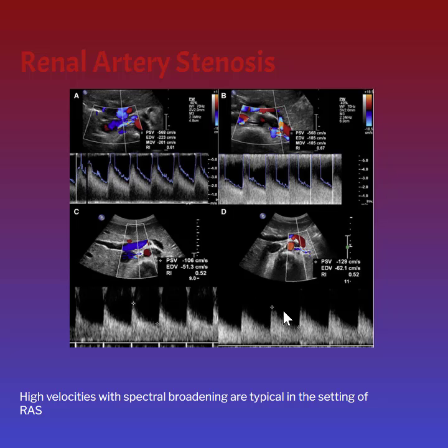And that is the end of our review of renal artery stenosis. You will study this more in depth in your vascular classes, and board questions will be more prevalent on your vascular boards. However, you do need to know the basics of renal artery stenosis and how we diagnose it for your abdominal boards as well.